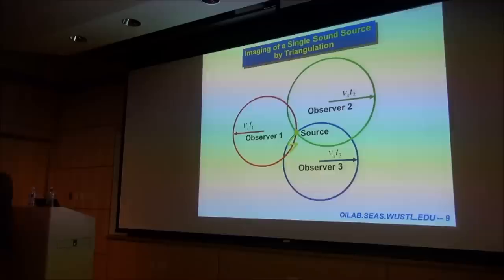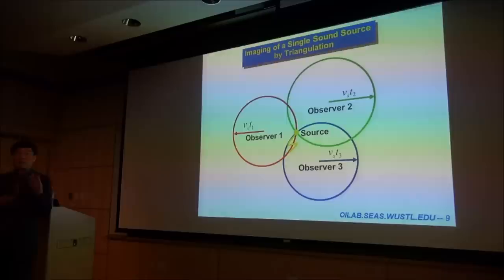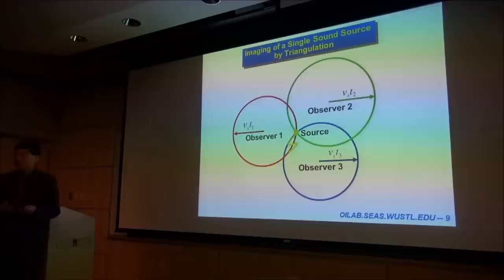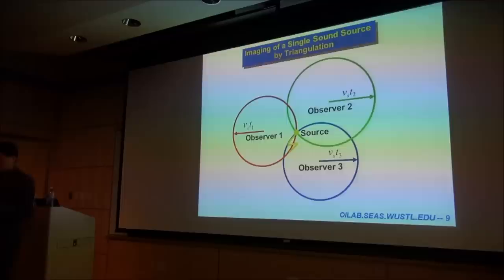And Simon and I were talking about light propagation. To record a light propagation time is a lot more challenging because you're talking about five orders of magnitude difference in the propagation speeds. Right? So this allows you to reduce one detection dimension, because you have the time dimension, so the spatial dimension can be reduced. Now, if you look at X-ray CT, you have to do this type of linear scanning or a fan beam scanning.